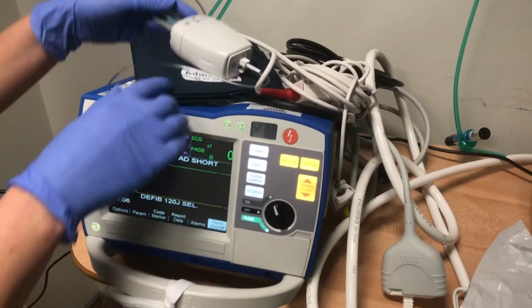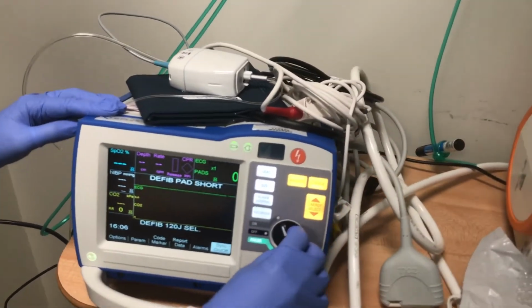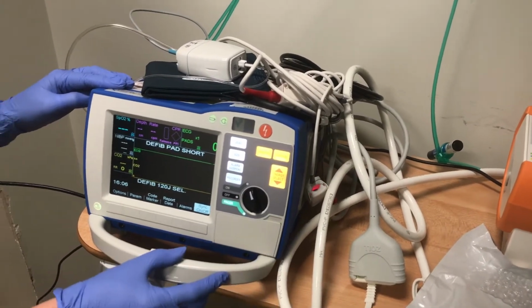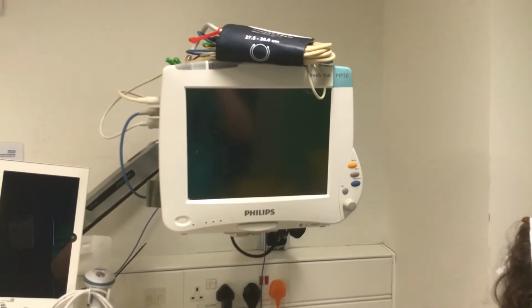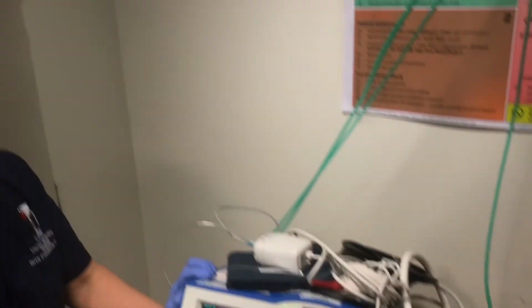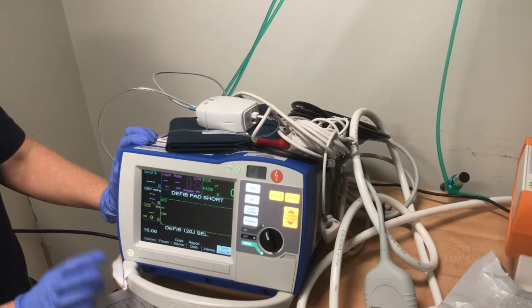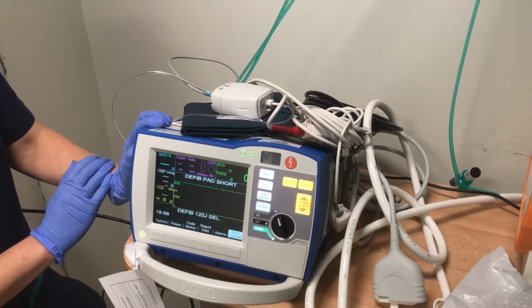One important thing to note is that you cannot connect an arterial line trace or a CVP line trace to these monitors. So if your patient has got an arterial line or a central line in, we're going to be using the Philips monitors, which are static in each bed space, purely for the monitoring of these two things. We will have a transfer monitor, so if you need to transfer a patient and have ongoing arterial line and central line pressures, that is possible to do, but it will be on 2 different pieces of monitoring kit.